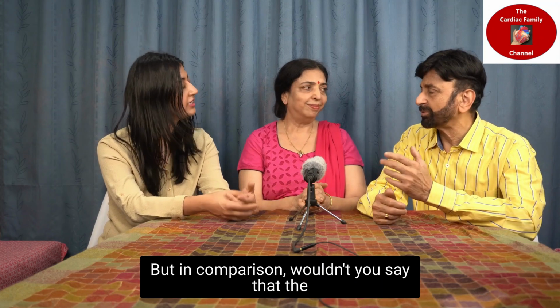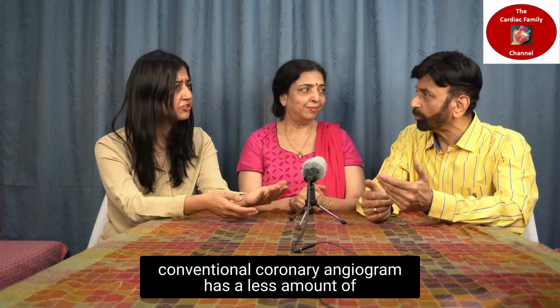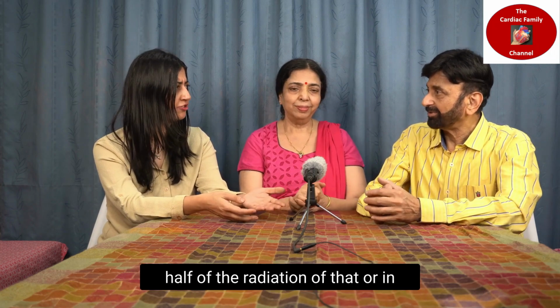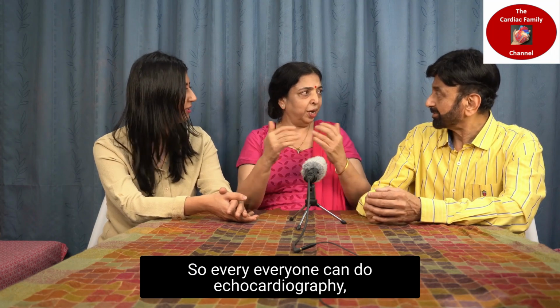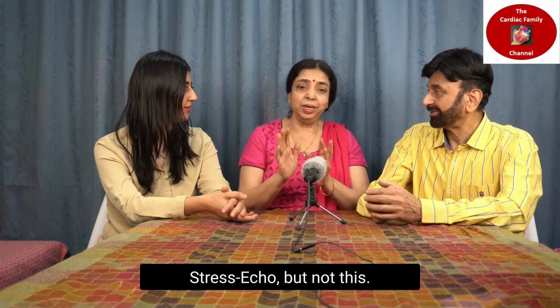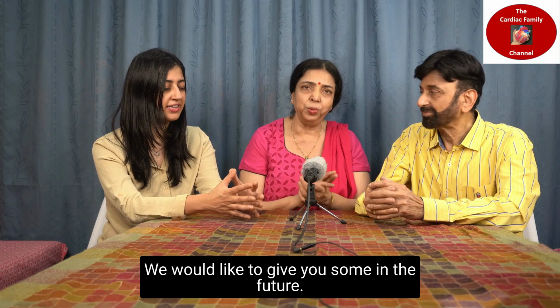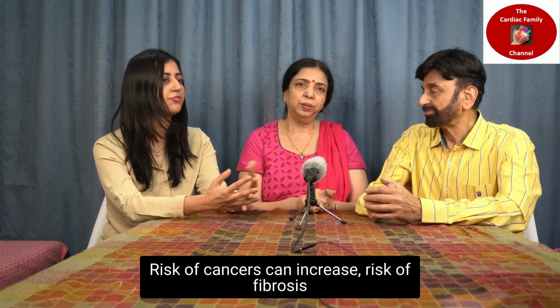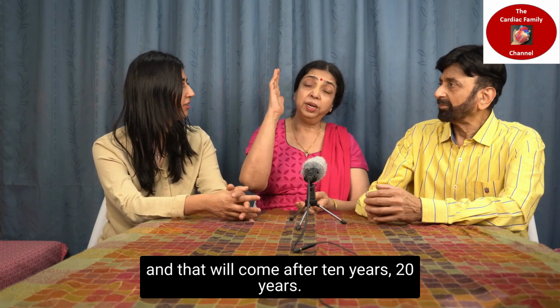But in comparison, wouldn't you say the conventional coronary angiogram has less radiation than CT? Less than half of the radiation, yeah. So every year one can do echocardiography or stress echo, those are physiological and quite safe these days. That is a very important message, because radiation has its harm in the future. Risk of cancers can increase, risk of fibrosis, risk of heart blockages, and that will come after 10 years, 20 years.